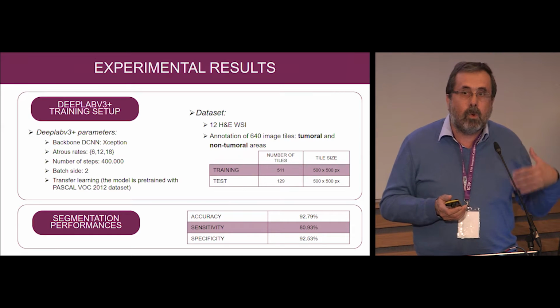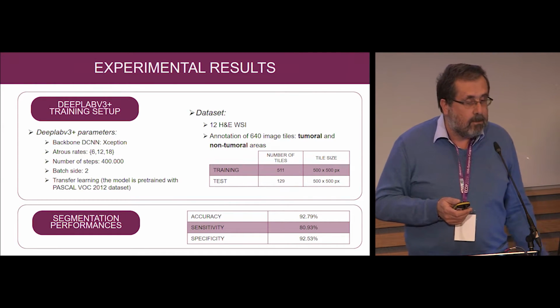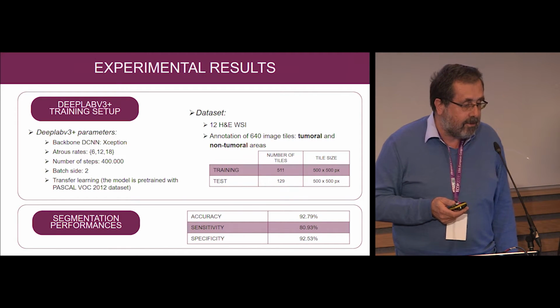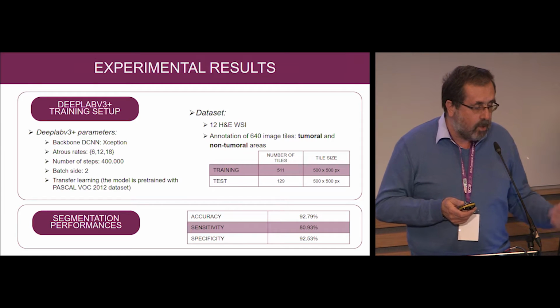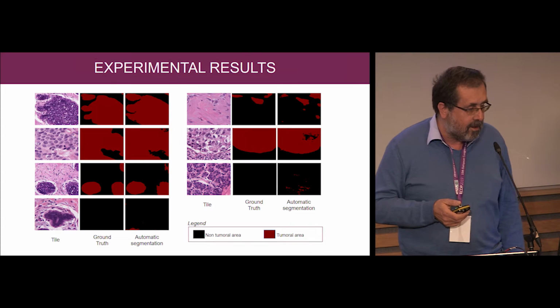And this is why we want to add additional parameters like finding in the stroma, of course, training more cases and more tiles in this platform, and we are sure that we could obtain better results in the next phase.